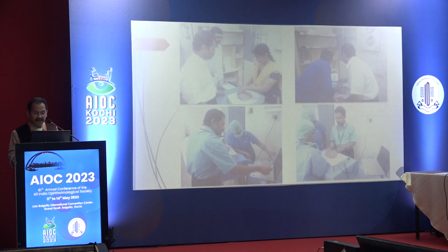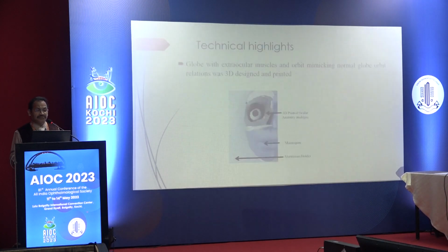Now, with this as background knowledge, we developed this real-time view mannequin where we can see the participants performing the blocks in the simulators, and at the same time they can also view the system, how they perform the blocks, the needle track, everything we can teach the participants.